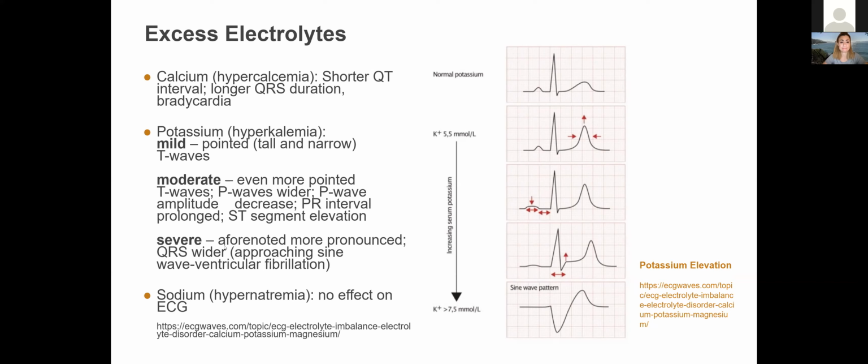At the severe level, everything is going to become even more pronounced. The QRS period will be wider, as you can see here with examples of increasing severity. And with sodium hypernatremia, there'll be, again, no effect on the ECG.